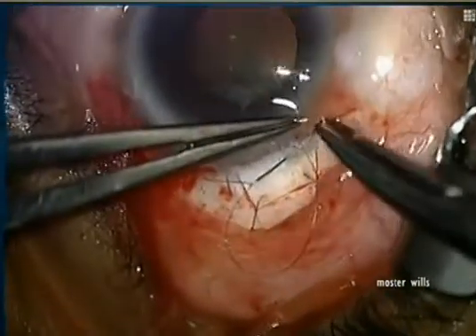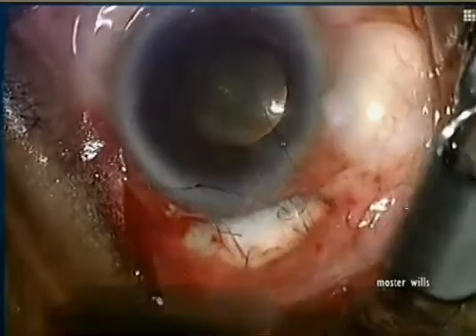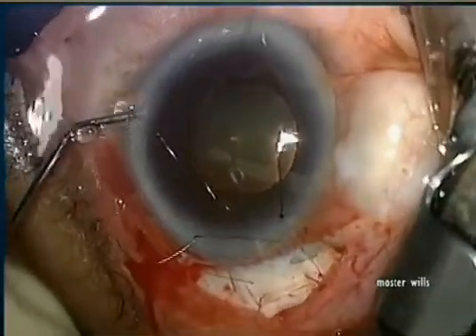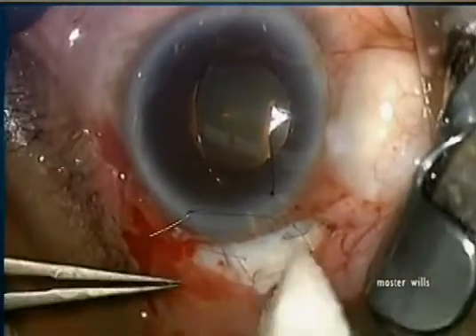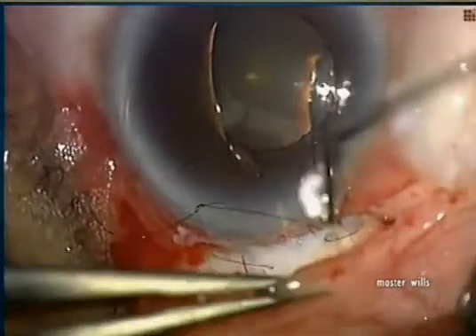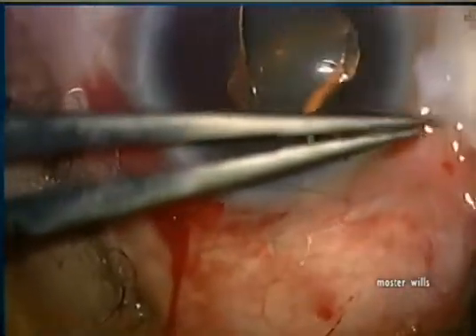Because his pressure was in the high 30s, we put in two releasables so I can cut one early and then one later to stepwise lower the intraocular pressure. The back sutures are fairly loose with adequate flow out the back immediately — so the front is tight, the back is loose.